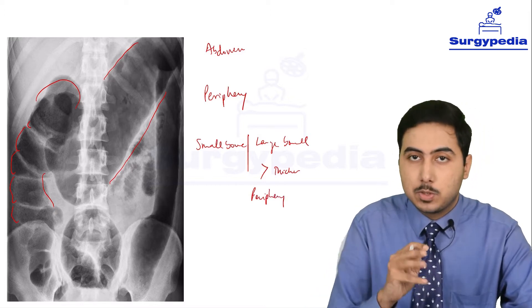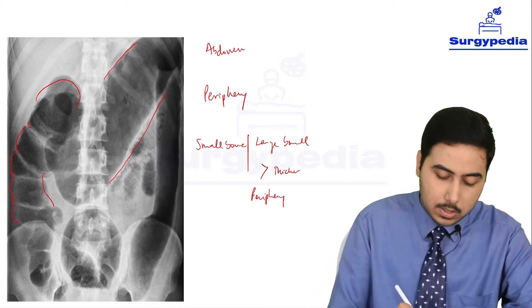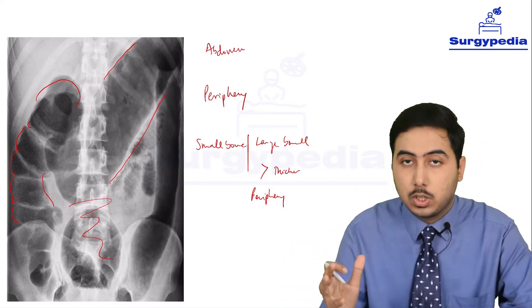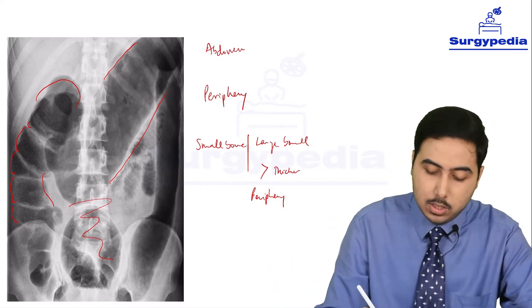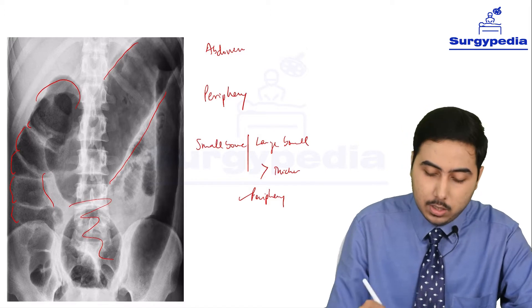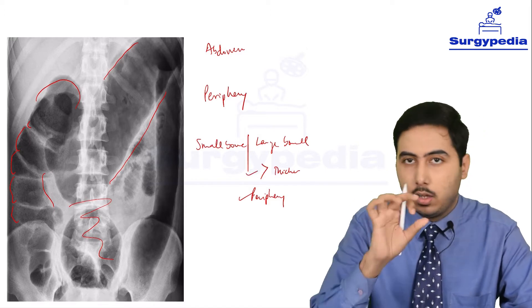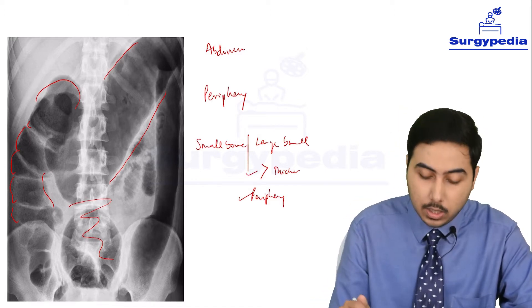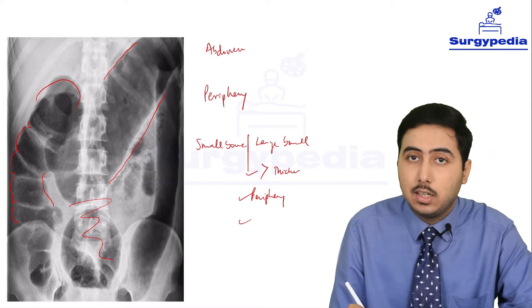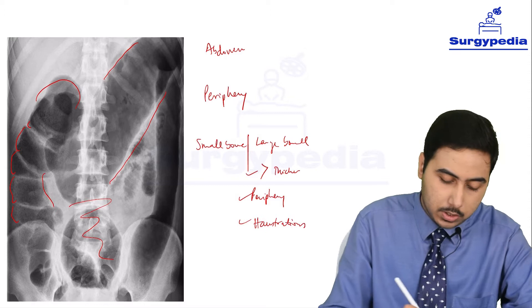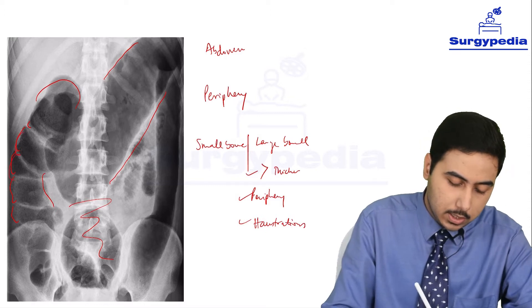Small intestinal obstruction would present in the center, but large bowel obstruction presents along the periphery. That is another point, and that is matching with our finding. Thick diameter is also matching with our finding. Another finding we have discussed is haustra markings - we can observe the haustra markings here as well.